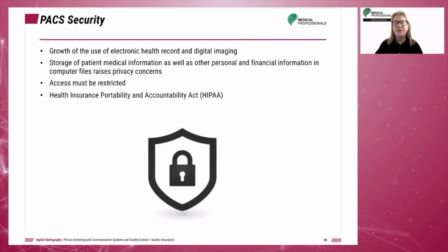The use of computers in healthcare has seen rapid expansion, and that trend will only continue to grow. While there are many advantages to electronic access to medical information, including medical imaging, there are some drawbacks.